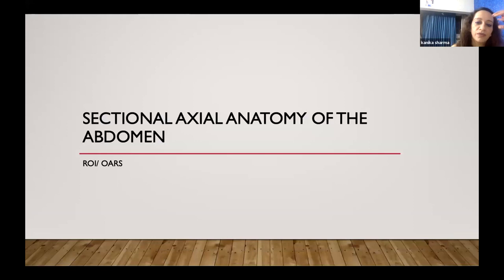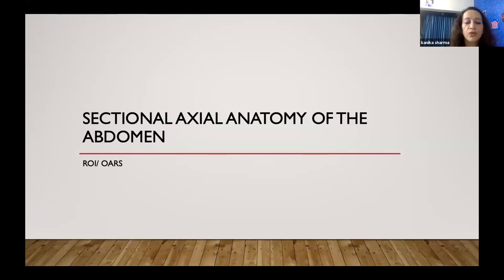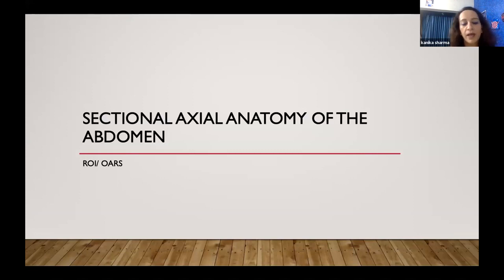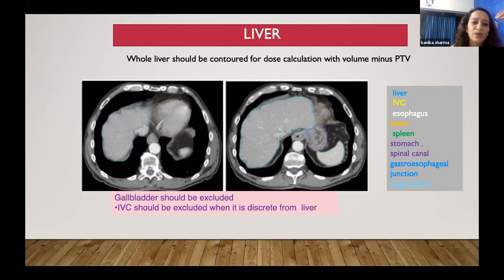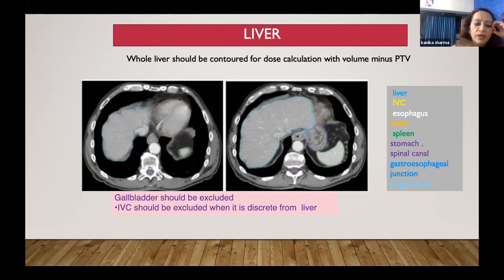Before actually drawing CTVs, in this particular site it is important to first draw your OARs — also called regions of interest — because they form the framework for the CTVs. Your entire CTV is based on expansions and abutments from these ROIs. Liver seems like a very simple organ to contour, and when you start contouring, liver and lungs are the ones you feel most comfortable drawing. However, there are small things you should pay attention to when contouring liver for hepatobiliary malignancy.